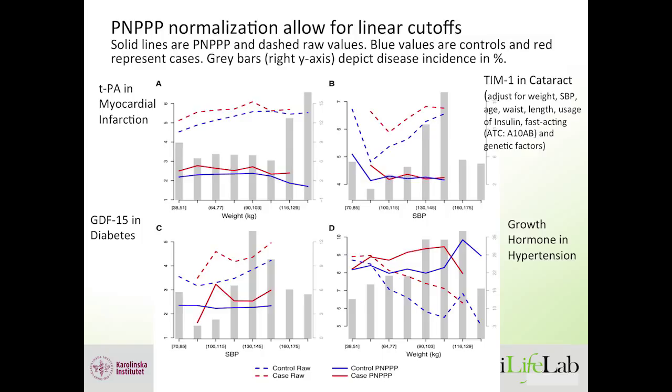So these are after we've adjusted for all the covariates. You can see that the cases are all across the whole weight spectrum. They're always above the controls, which makes it essentially possible to put a clinical cutoff right here, and that goes across all the covariates, all the different differences between patients that may exist in other respects.